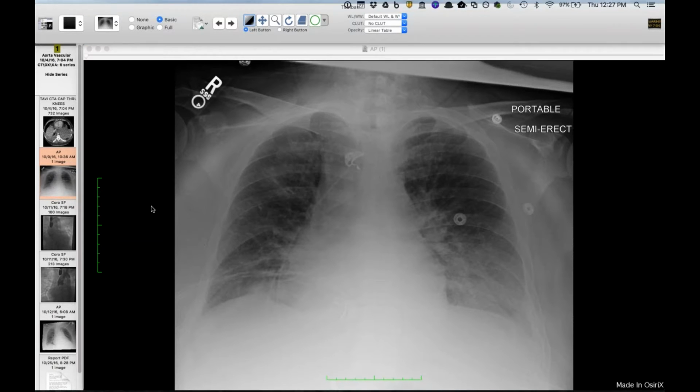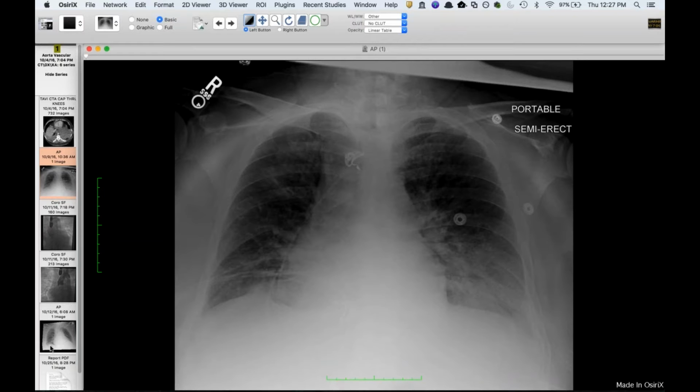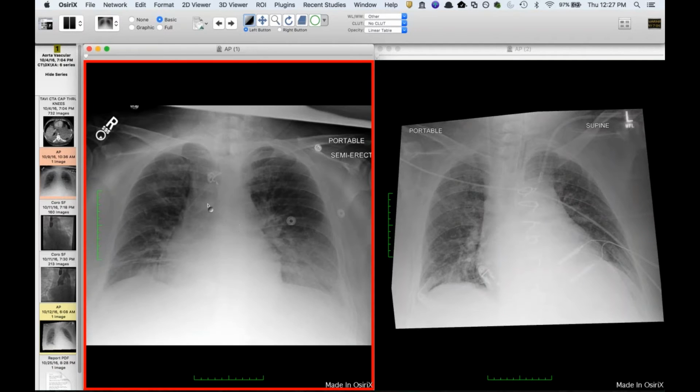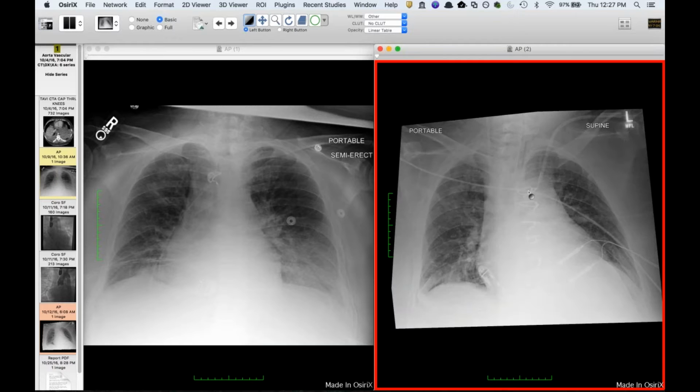I think I pulled up the wrong fluoroscopic study to show you before. And then this one is another one that has a fluoroscopic correlate. You can see that this is a patient who looks like he has some pulmonary edema when he came in. He's a young patient who had aortic valve endocarditis, and you can see between these two studies that he ended up with a median sternotomy.